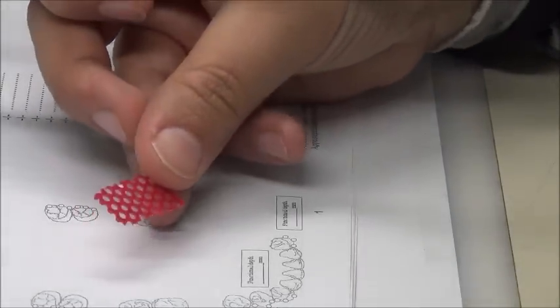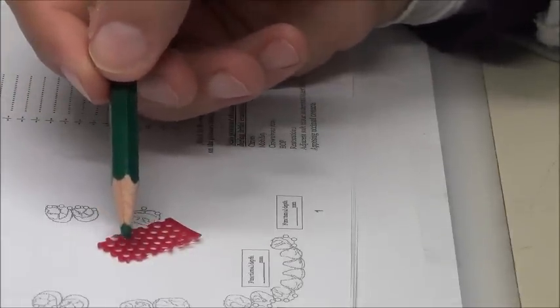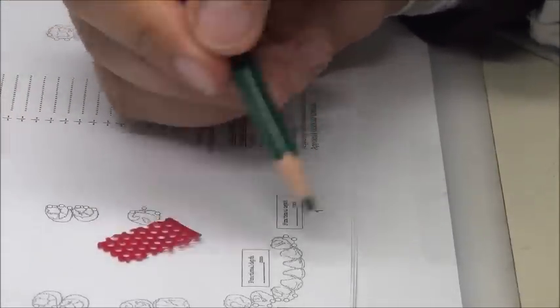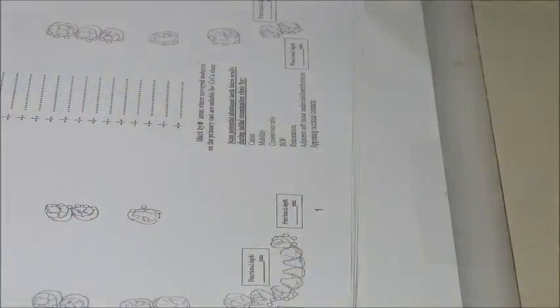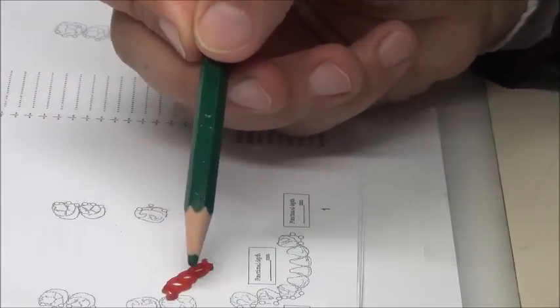The acrylic comes through the mesh and contacts the lower layer and upper layer through the holes. These holes are small, so we don't get the best retention. While with an open lattice design, we get large holes, and between these large holes the acrylic can bind better from the upper and lower layers.